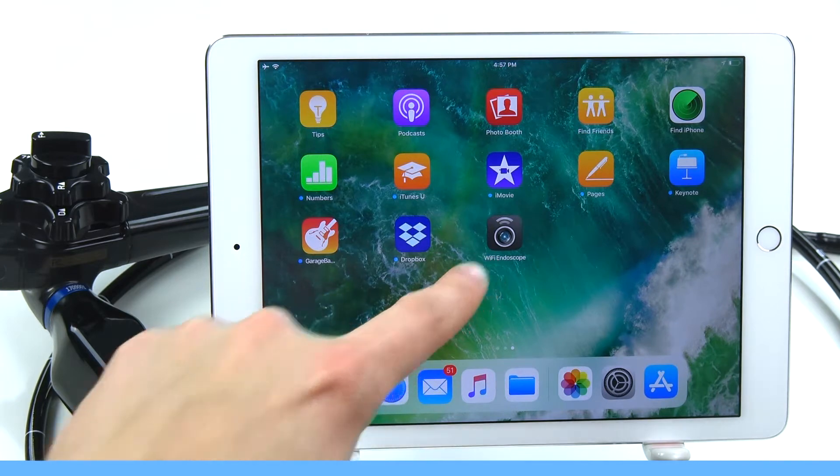After downloading, it will be placed on your home screen. Now that we have the app, we have to make the EndoI communicate with the tablet via its built-in Wi-Fi module.